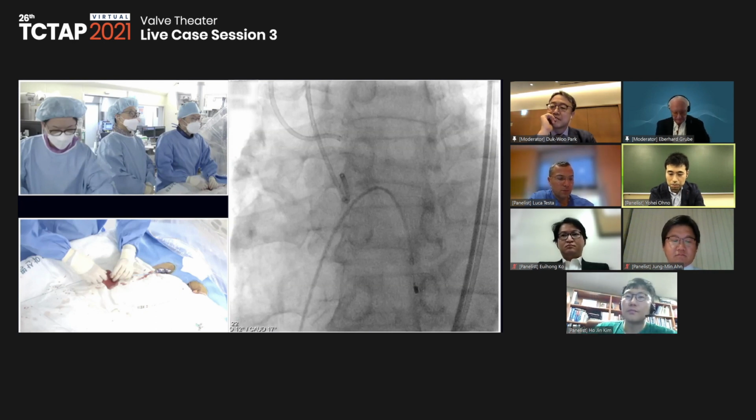Maybe it's feasible because our Japanese patients have relatively small body size, like BSA of 1.3 or something. We can have a very nice image with only low dose CT contrast. And if we give enough hydration to the patient, usually we don't get acute kidney injury with a low dose contrast.